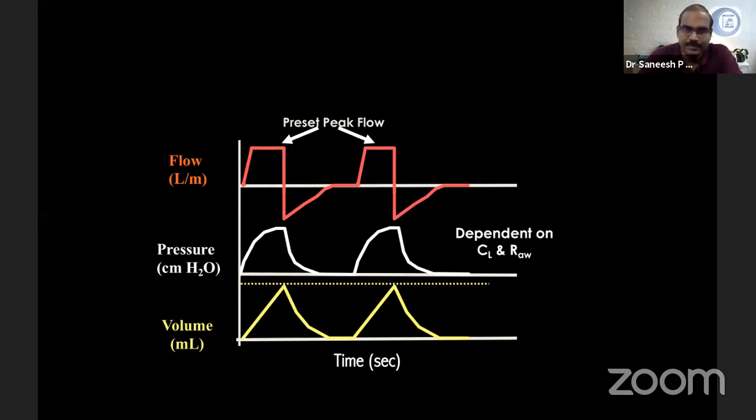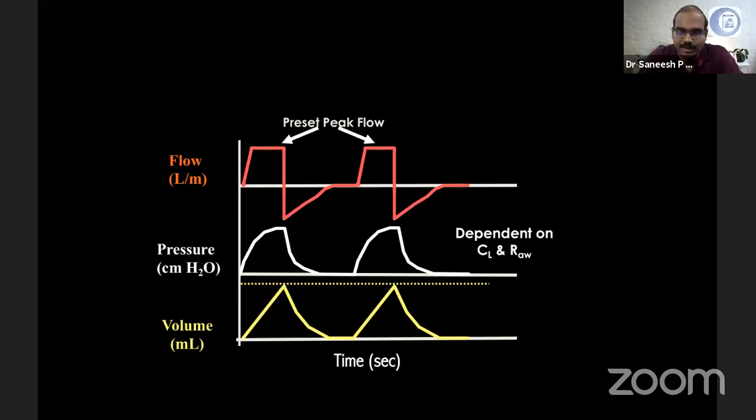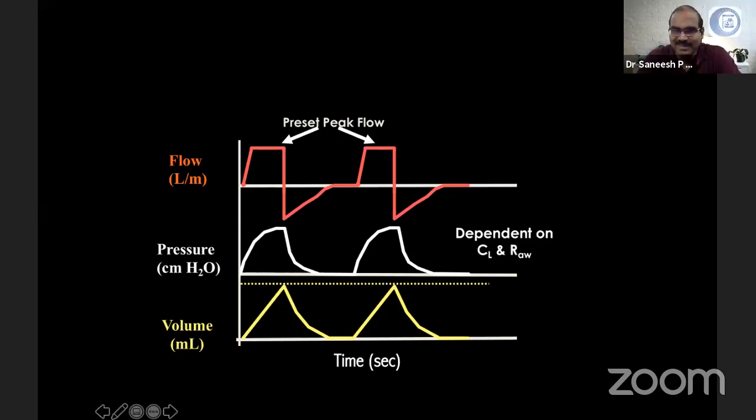Okay. Fine. What about the second breath cycle? The second breath cycle also shows the same square graph. So it's also a mandatory machine triggered control mode ventilation. Okay, mandatory volume control breaths. The peak inspiratory pressure is the same as in the first graph, but the inspiratory time is somewhat shorter than the previous graph. Okay, so we'll concentrate on this part.